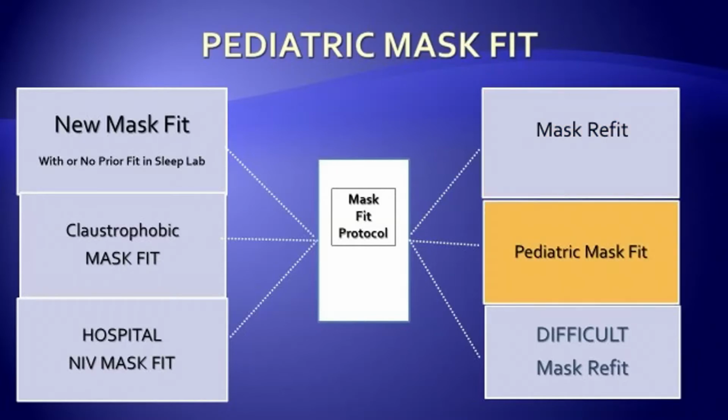The next situation is the pediatric mask fit. This is a situation where the child has had the tonsils removed and there is subsequent swelling that caused airway obstruction with the need for CPAP via mask. The goal here is to try to get the patient to wear the mask. Unfortunately, the child doesn't understand, and that's where the mother or the caregiver is needed to play games with the child to get the child to accept the mask.